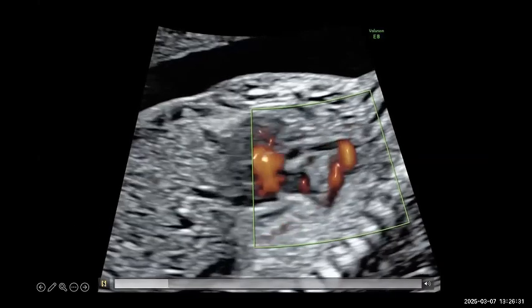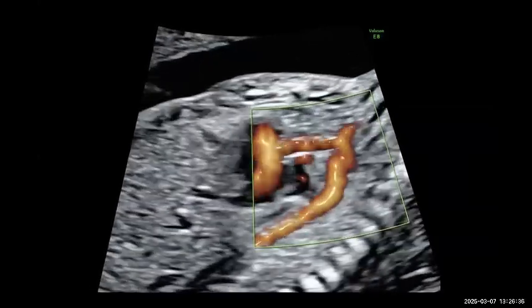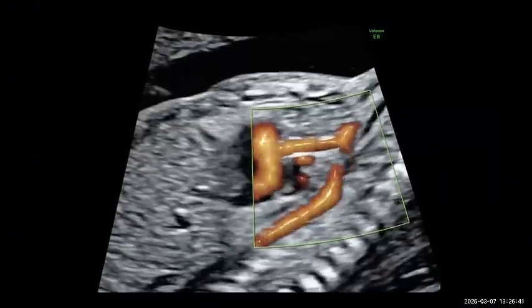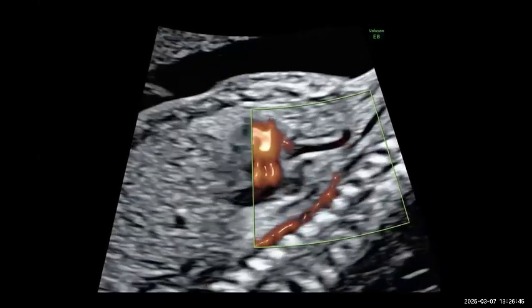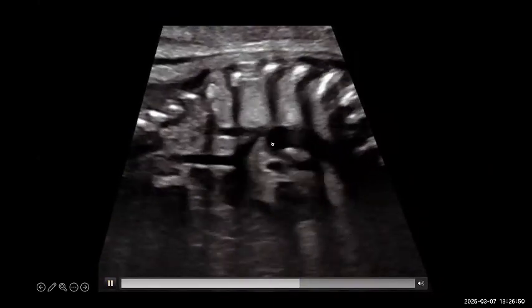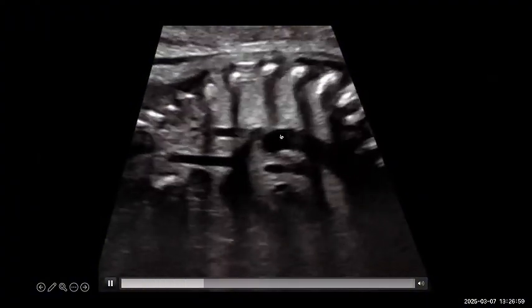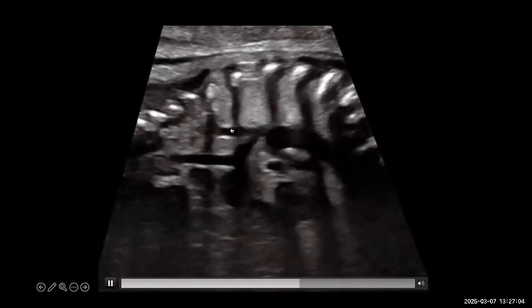I am following up this baby. There was also a small and narrow LVOT. The mitral valve presents a degree of hypoplasia. I don't know how we will eventually manage this baby after birth, but the pregnancy is still ongoing. When a patient presents like that, it is very easy. We can see a very diffuse arch hypoplasia. The arch is the same size as the common carotid and left subclavian arteries. There is a posterior shelf, very obvious disproportion, and increased distance between these two vessels.